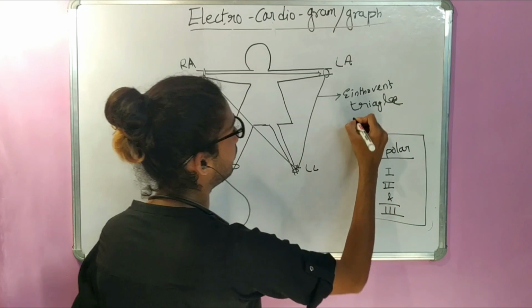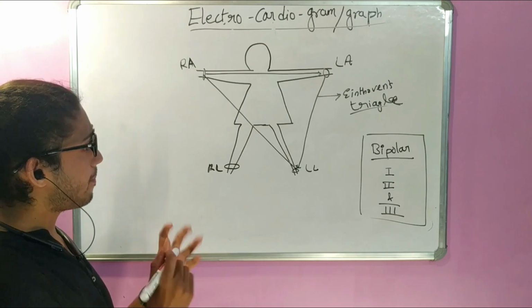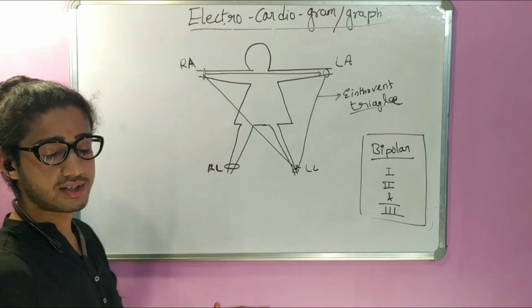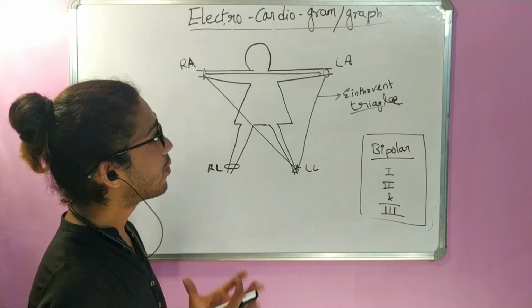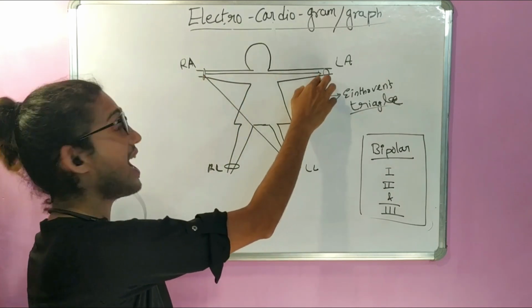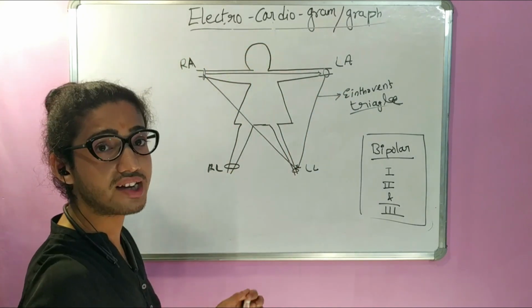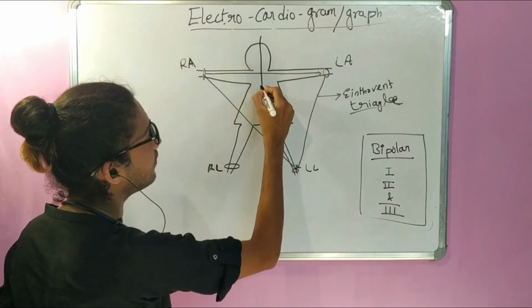You can also make a note, guys, if you want to keep in mind to understand it better. Now, what happens exactly is there are 3 terminal ends to this triangle. So what actually happens, this electrocardiogram machine splices the information received here and combines the information. The machine itself is very smart to do this. It combines the information, computed information, and gives us the view from the top. So this is the first view that we get to the heart.